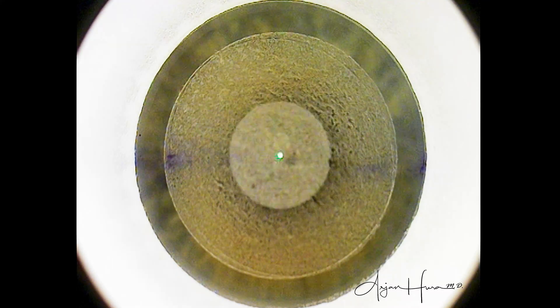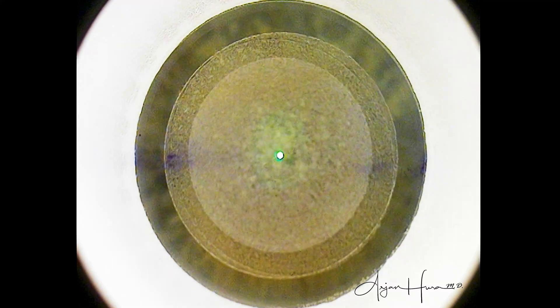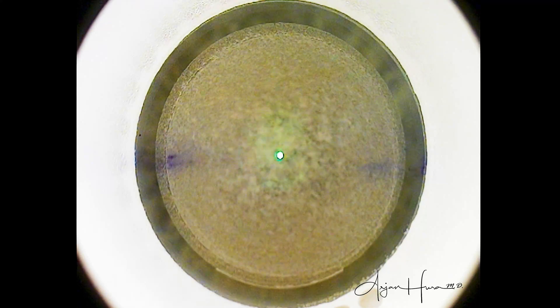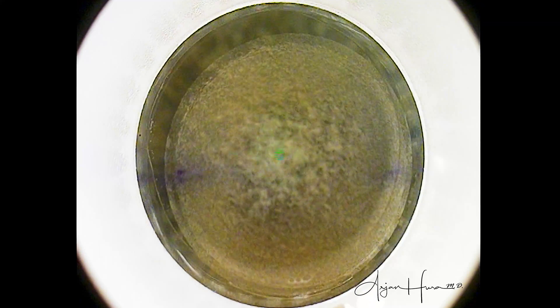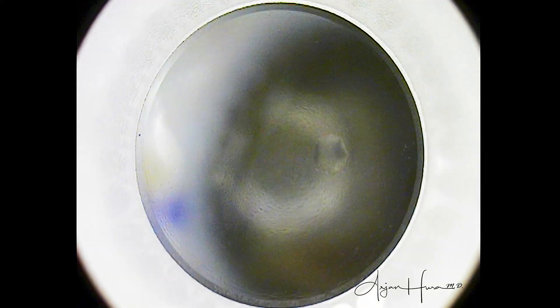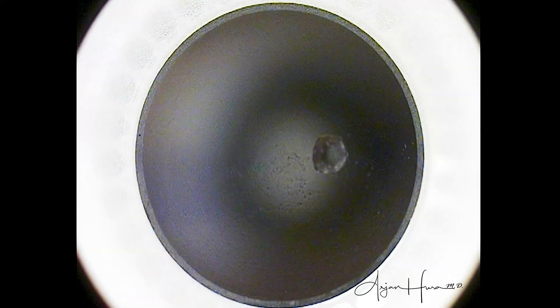Then this inside-out cut establishes the top of the lenticule and the SMILE pocket. And then finally, the superior incision, which will give us access to the lenticule. That entire process of creating the lenticule took exactly 24 seconds, and that holds true regardless of whether the patient has a -1.5 or a -8.5 refractive error. The time to create the lenticule is exactly the same.